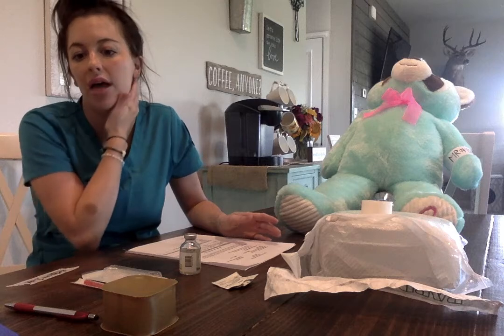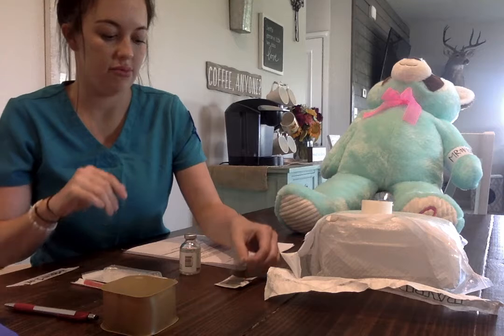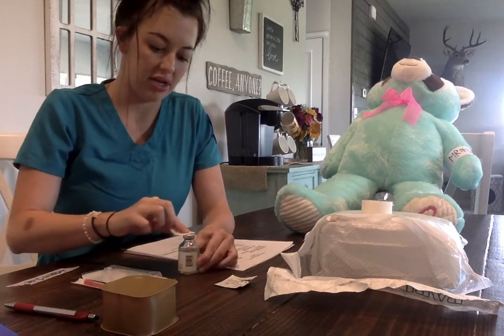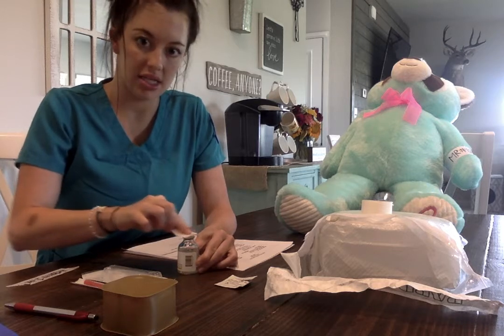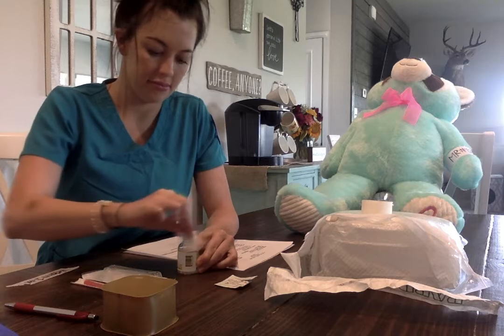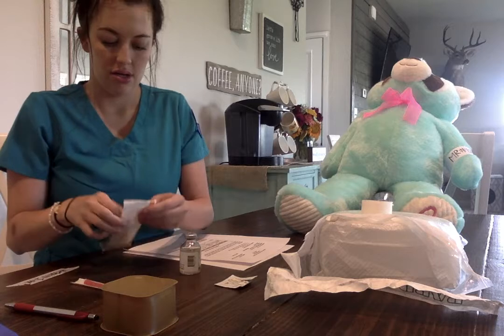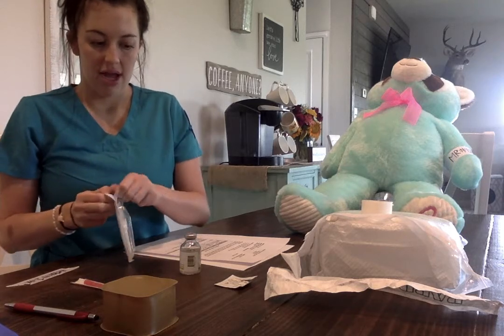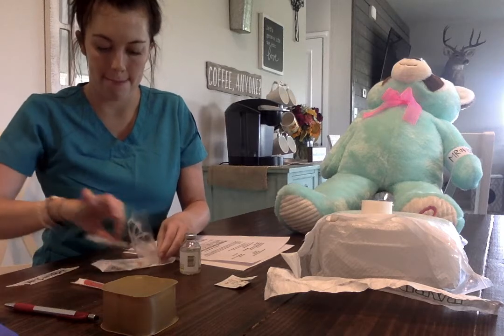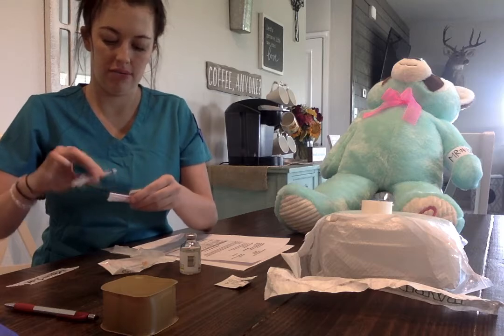So I'm going to go ahead and draw up the meds. We'll start with an alcohol pad, and I'm going to clean it from inner to outer for 30 seconds. Okay, throw that away. While I allow that to dry, I'm going to draw up using a blunt tip needle.